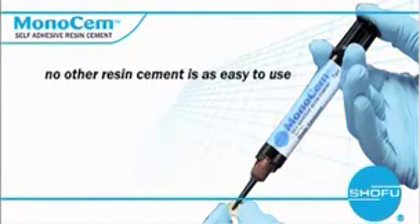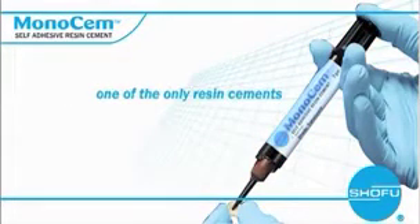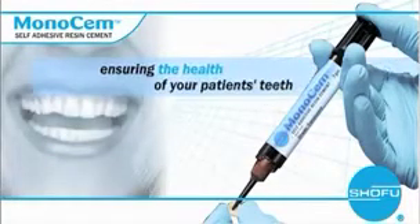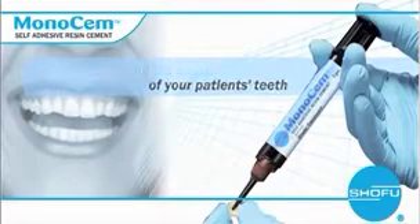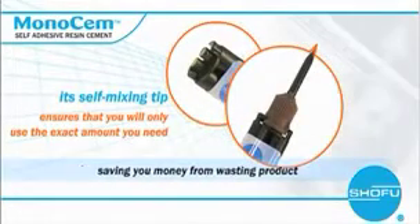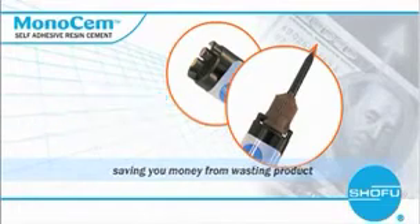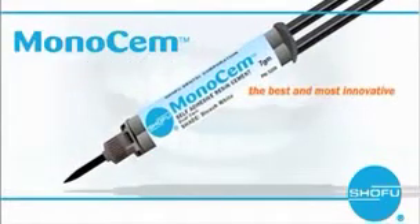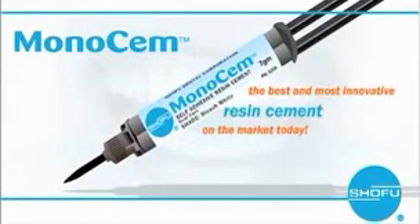Shou Fu's Monosem is one of the only resin cements on the market that actually releases fluoride, ensuring the health of your patient's teeth continuously for years to come. Its self-mixing tip ensures that you'll only use the exact amount you need, saving you money from wasting product. No etching or bonding means big-time savings. For any crown, inlay, bridge, onlay, or post, Shou Fu's Monosem is the best and most innovative resin cement on the market today.